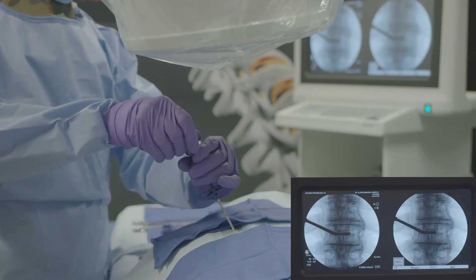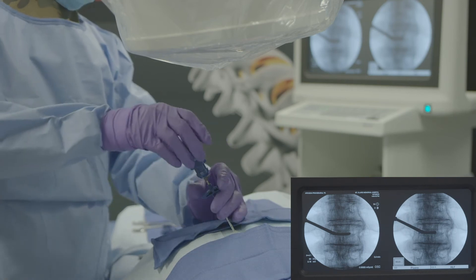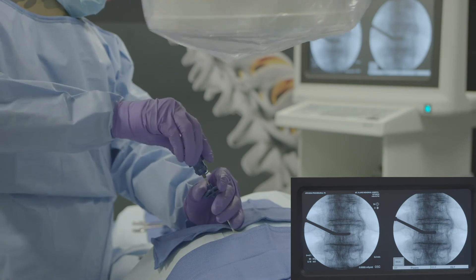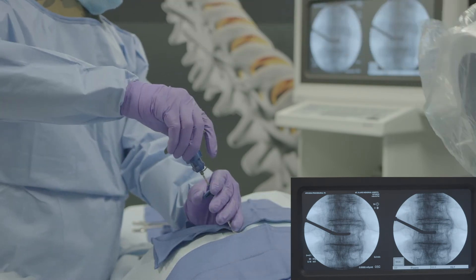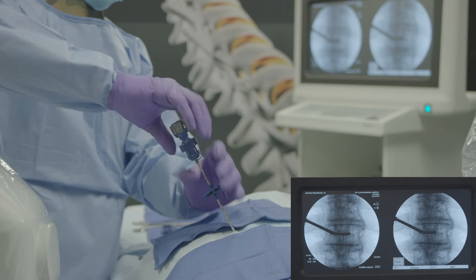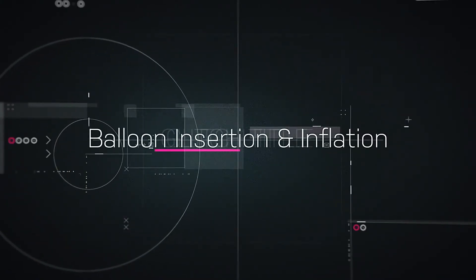Remove the power curve navigating osteotome in the reverse order. Take care to alternate dearticulation and withdrawal. Verify under lateral fluoroscopic imaging that the power curve navigating osteotome is clear of the anterior wall.